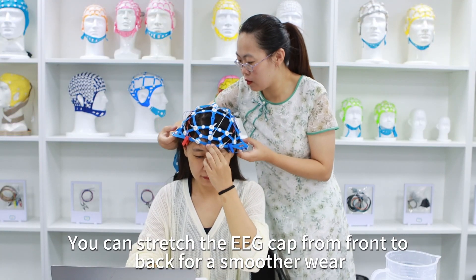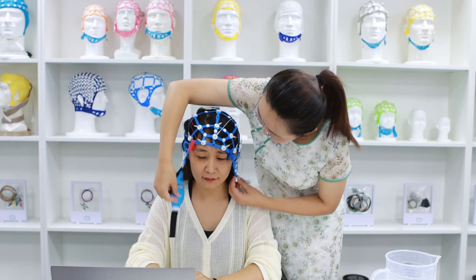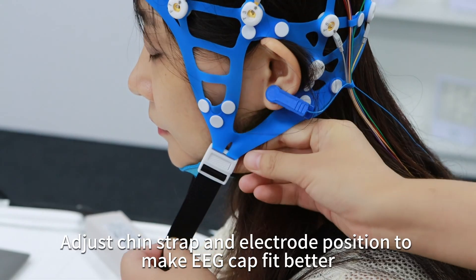You can stretch the EEG cap from front to back for smoother wear. Adjust the chin strap and electrode position to make the EEG cap fit better.